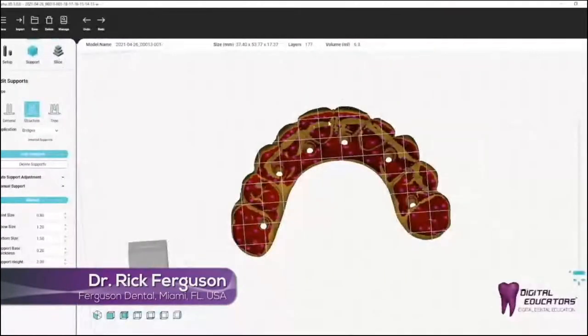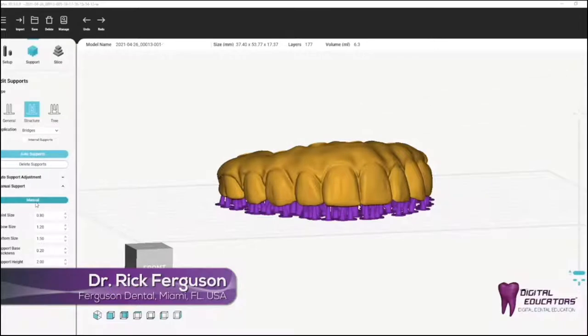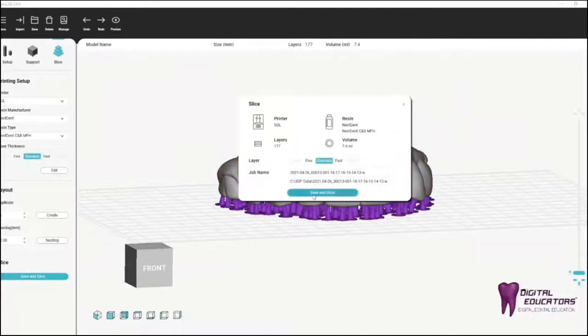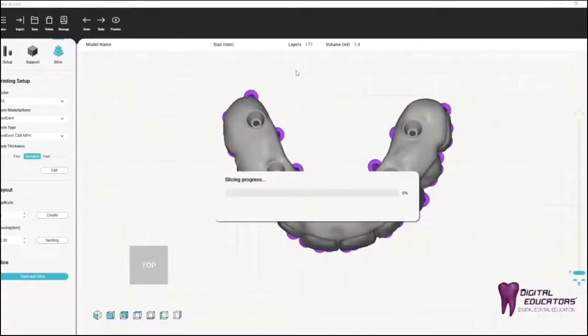So we're done with the manual adjustments, and we're now going to do our slicing. So we're going to go ahead and slice. And once the slicing is complete, the software is going to save that on your computer. It's going to save the slice file. So once that slicing is done and it saves the slice file, we can then send it to the printer. So you can see the slicing process happening right now. This usually doesn't take very long.